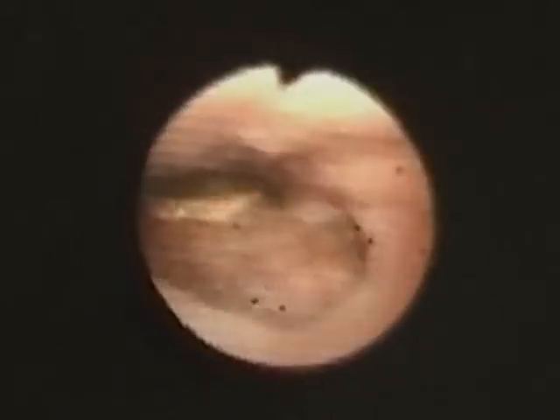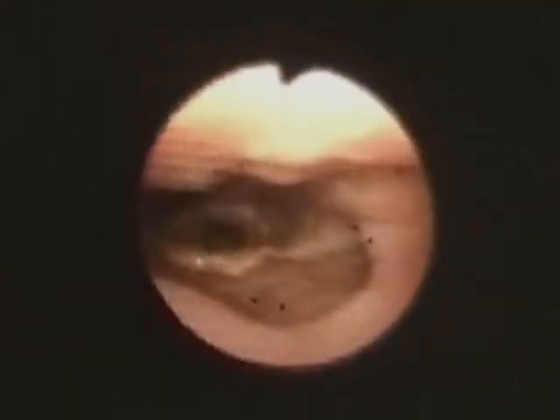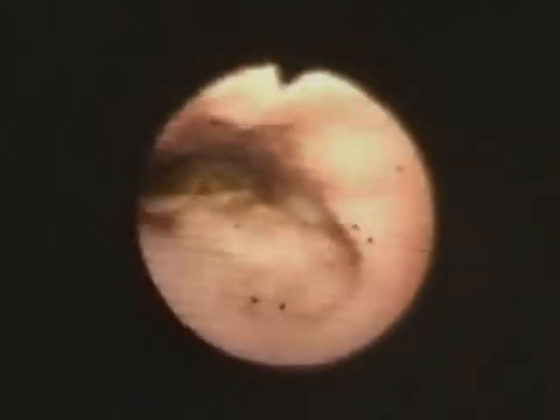Slowly flex the tip downward as you turn the corner into the posterior pharynx, behind the uvula. As you pass around the base of the tongue, you should see the epiglottis and then the larynx.